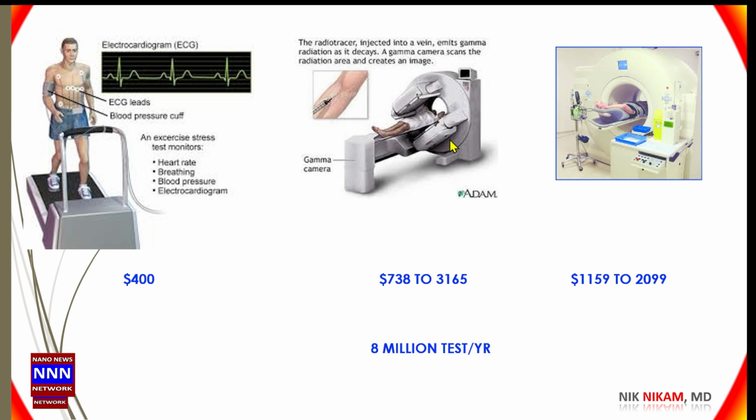It can be set up in any community hospital. I had a nuclear stress test in my office while I was in full-time practice. And this is something that can be done in any small setup. Whereas PET CT scan is a much more sophisticated test, and it needs experts in reading these tests. It can range from $1,200 to $2,000, or maybe as much as $10,000. It all depends upon whatever that place can charge and get away with it.